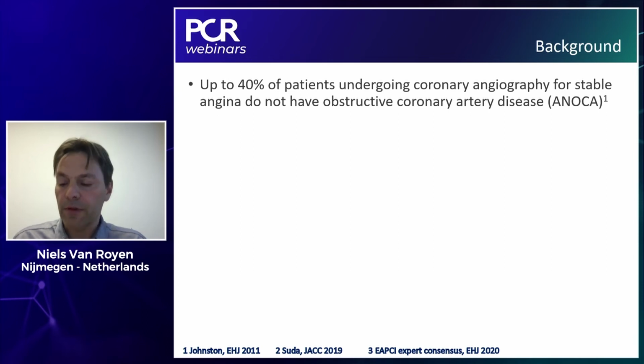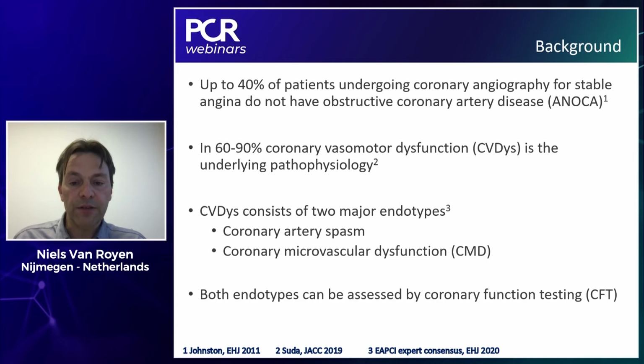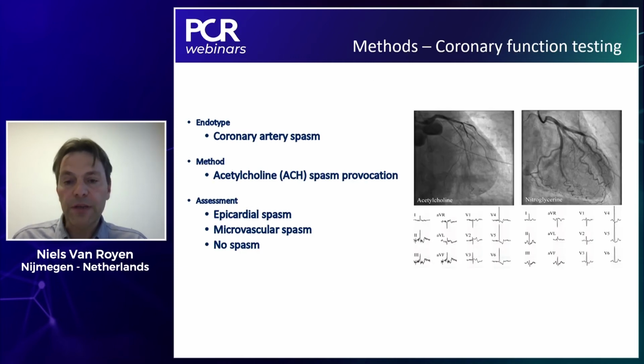I'll quickly go through these backgrounds just for the sake of time. But important to realize is that the coronary function test nowadays consists of two components. So you're trying to look for two different endotypes of coronary or endothelial dysfunction.